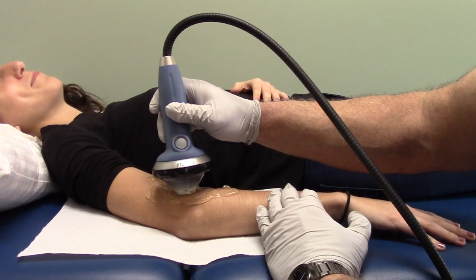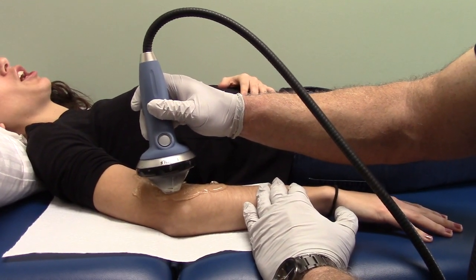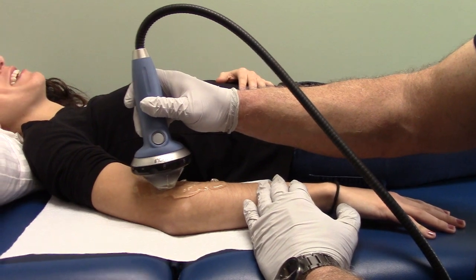How intense is it on a zero to ten scale? Maybe like a four. Is that tolerable or should I go down? No, that's good.